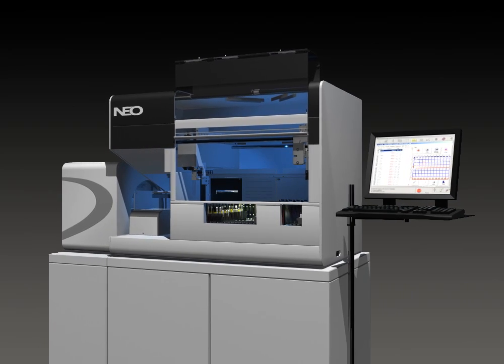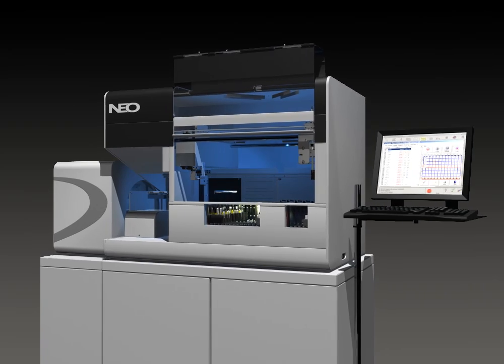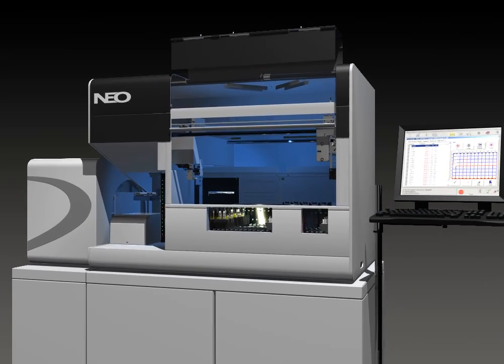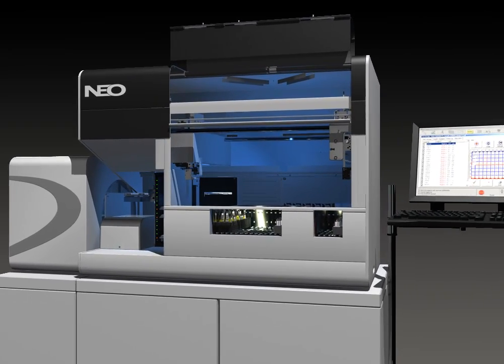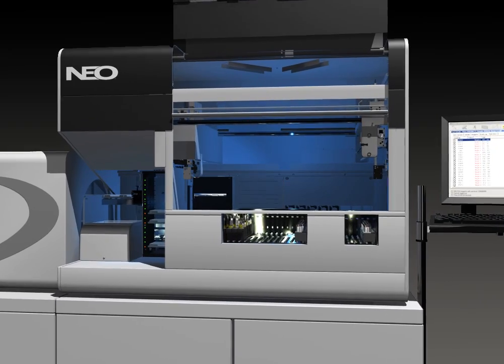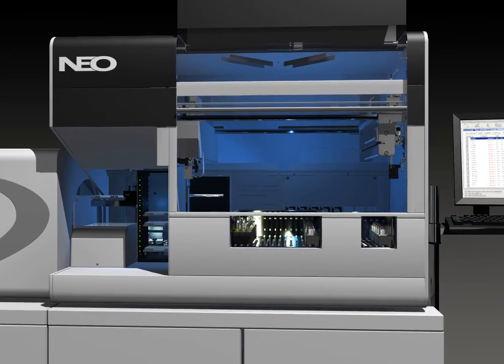NEO delivers a patient type and screen result in as little as 30 minutes or a high throughput of 185 pooled screens per hour.